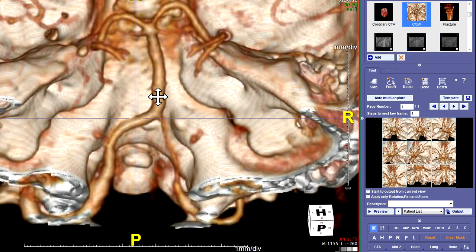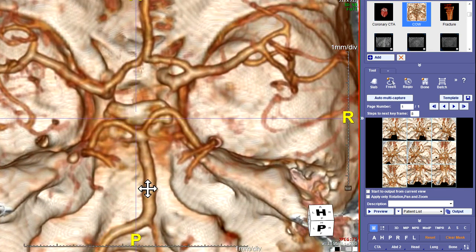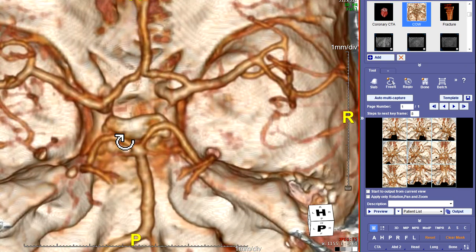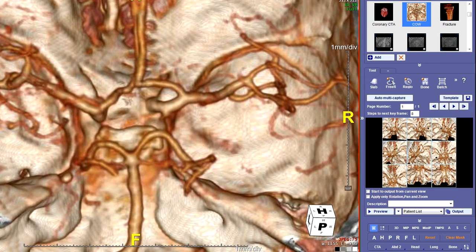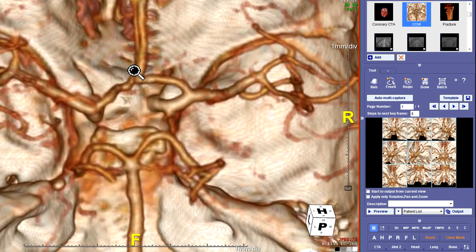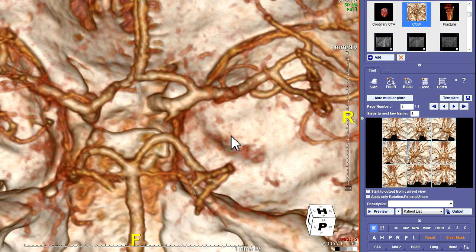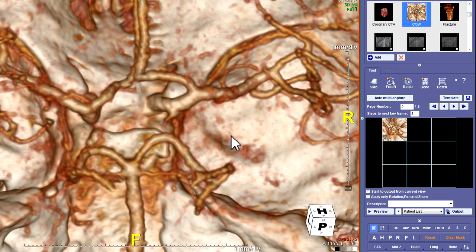At the very end, go back to the circle of Willis and get it laid out as best you can, then zoom it up real tight so it's real big, and capture that — that's the last picture. Then click Output and send it. Be sure it's set to save to the patient list. Click Output and it'll go to the patient list.